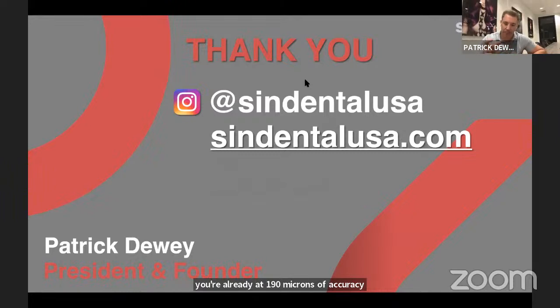My point is, we have tested this. We've got 10 95 printers in the back. We've got 18 55Ss. The 55 is significantly more accurate when it comes to implant restorations. We do not recommend, because we've learned this the hard way, we do not recommend the 95 for printing implant restorations, especially full arch fixed where there's multiple implants. So you can contact us, maybe Ryan or one of the team members, or even Sprintray. They do have trade-in programs if you wanted to trade in the 95.